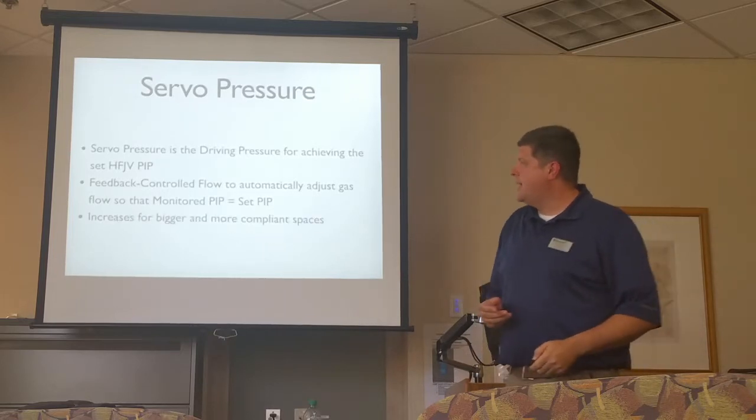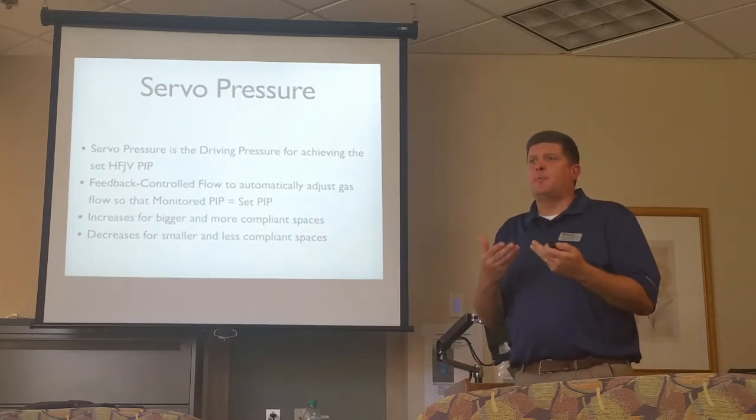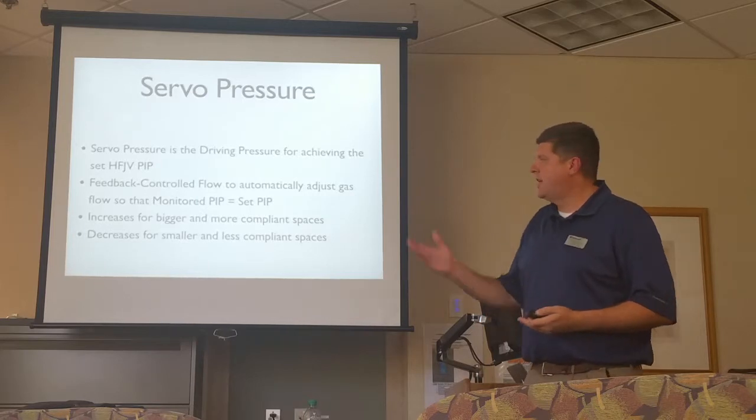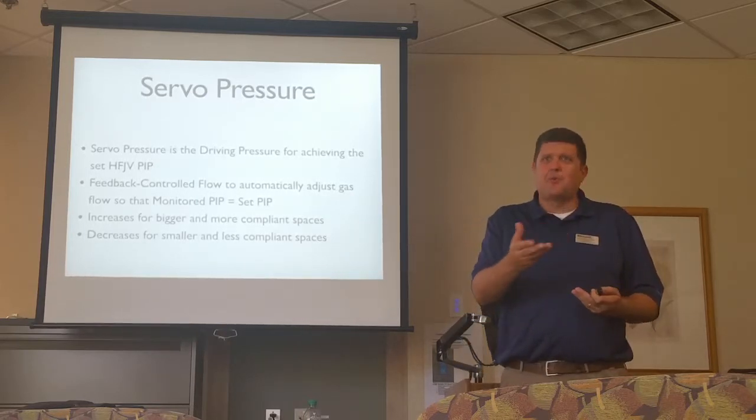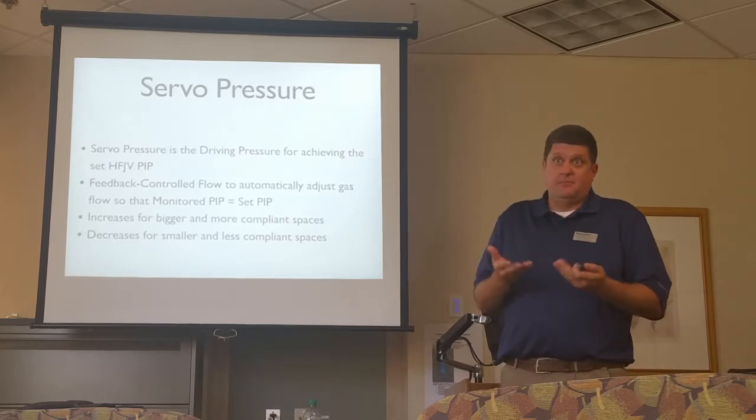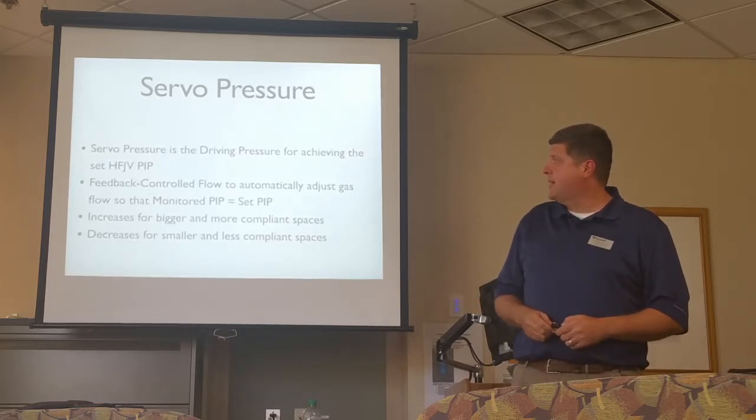And so it's going to change. It's a variable flow mechanism. As lung compliance and volume improves, you need more gas flow. So the servo pressure automatically adjusts itself to fill that volume and fill that space.